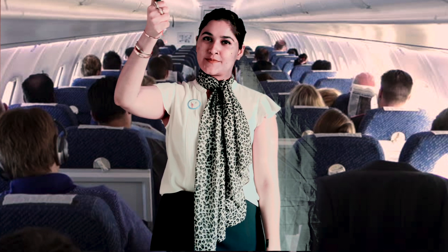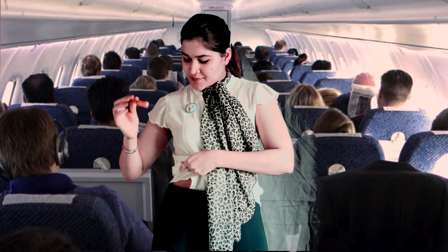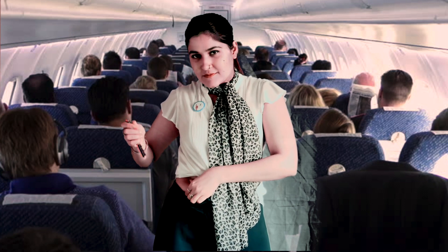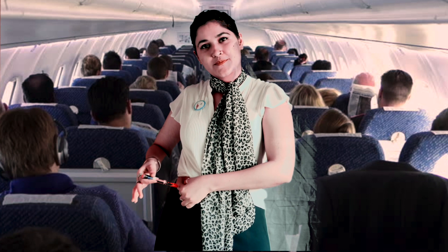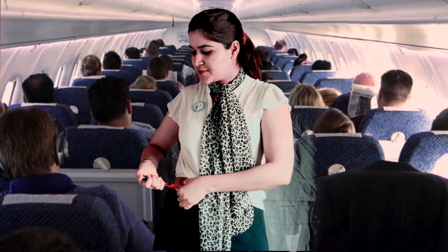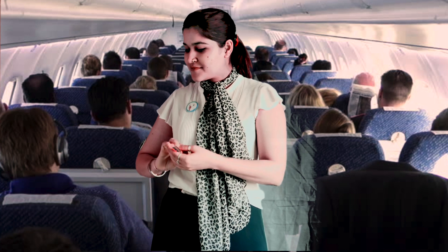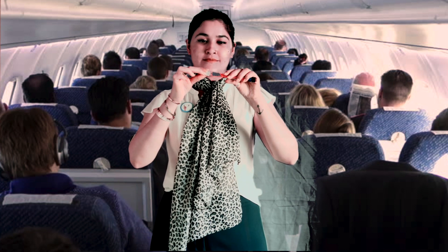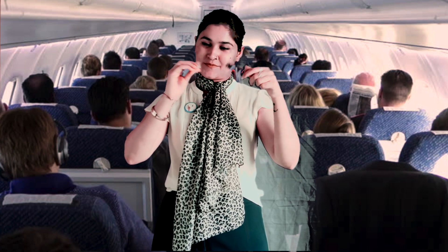Dial desired units, pinch skin with fingers, and insert at a 90 degree angle. Slowly release insulin and breathe normally. Hold for four to six seconds, remove, and twist back the cap to release the needle.